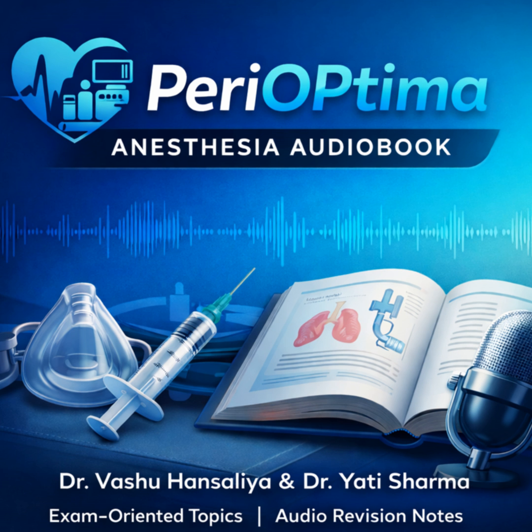I think a good place to start is right at the boundary between the patient and the OR environment, the anesthetic gas scavenging systems. We need to get waste gas out of the room. What's the fundamental purpose here? The purpose of the scavenging system, or AGS, is really twofold. First, you have to minimize staff exposure to waste anesthetic gases. That protects the people in the room and the wider environment. And this isn't just a regulatory checkbox.